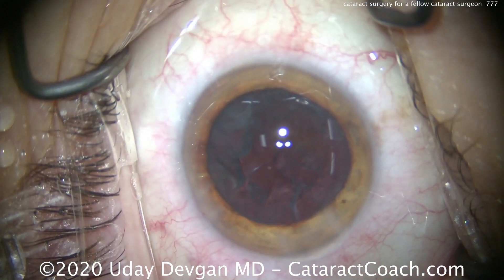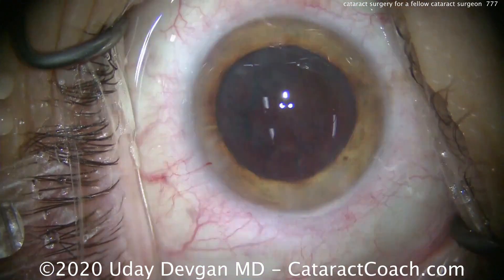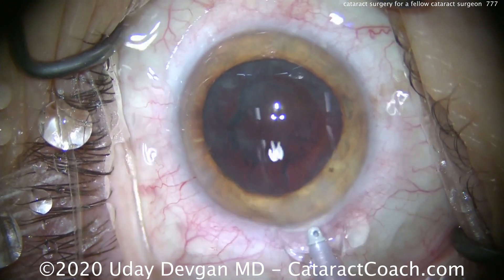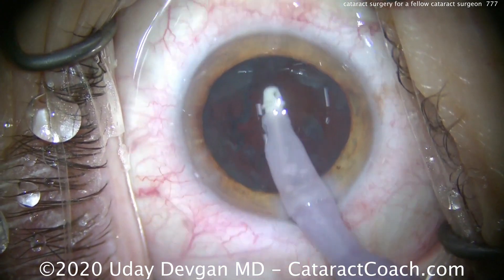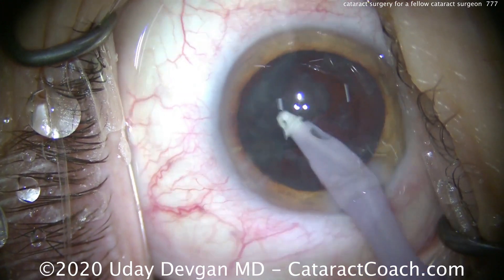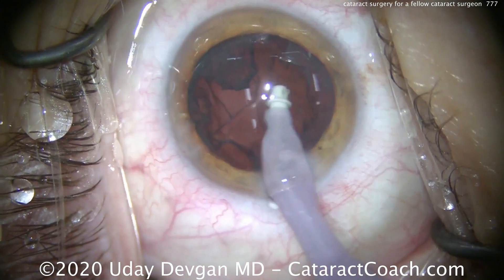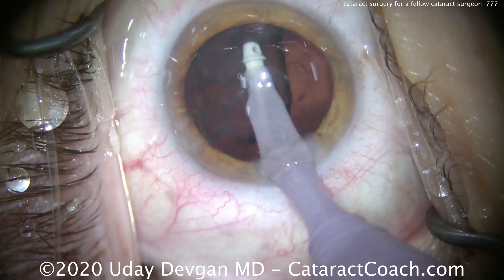This patient has chosen to remain myopic. As someone who's slightly myopic myself, I completely understand. With a low degree of myopia of about minus 2 or so, the patient is able to do all functions within the household without glasses, and is used to wearing glasses to drive, watch TV, or play distance sports. Now here comes the IA probe — we're going to do the cortex removal, and there's also a little epinuclear shell. All that will come out very easily.